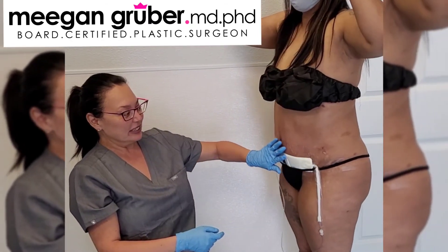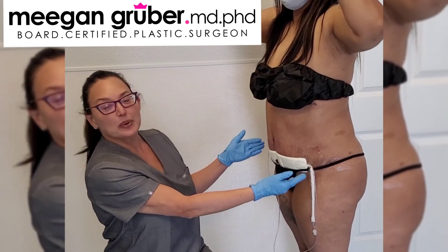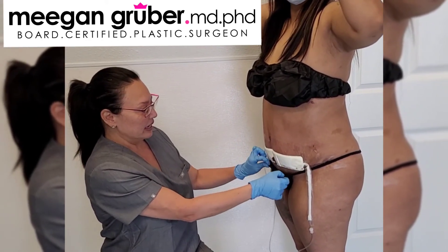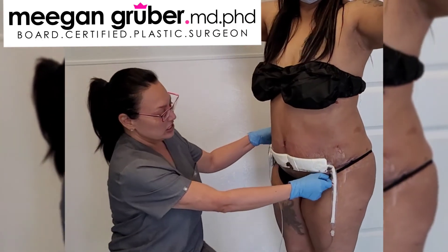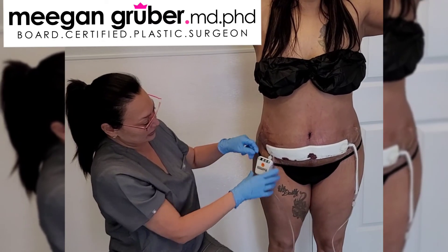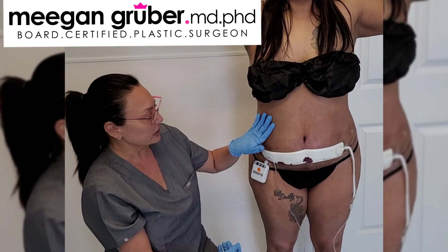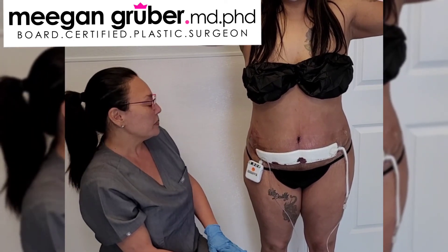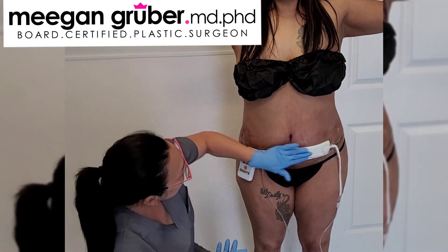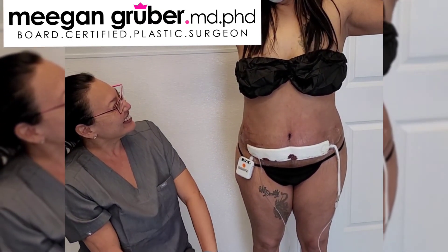This is the PICO device. We use different negative pressure dressings for patients, and again this just allows them to have no dressing changes. This is the suction device — it's very tiny and a lot more compact than the other system that we use, but it just depends on the patient. I'm really happy with how this is all looking. Thanks again for letting us watch your procedure.